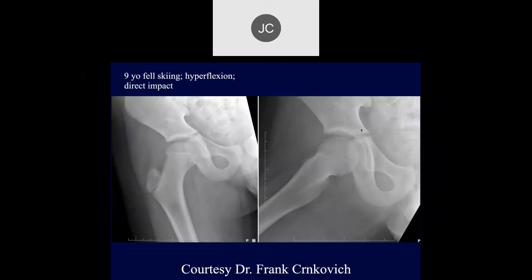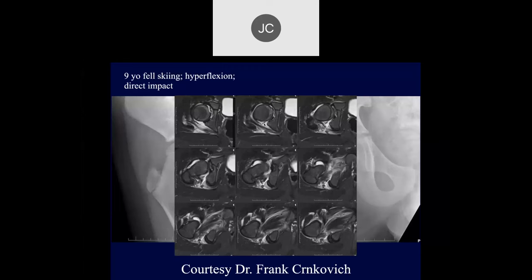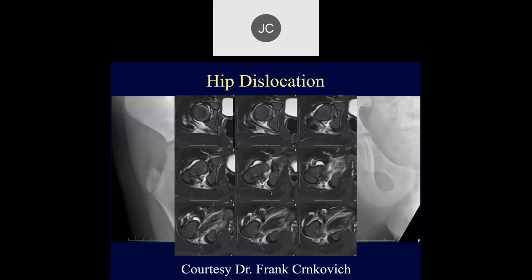Nine-year-old fell skiing, hyperflexion direct impact. There seems to be widening of the acetabular growth plate. On MR, the growth plate doesn't look too bad, but what we see is a lot of posterior soft tissue injury. This was a hip dislocation and a tear of the posterior capsule.